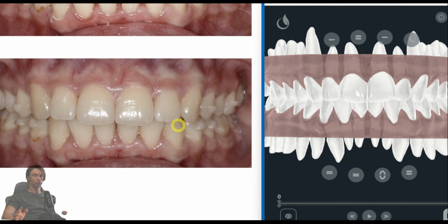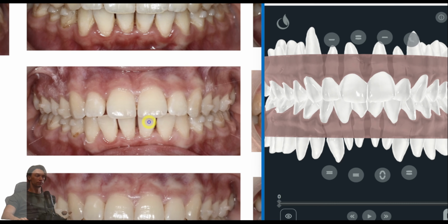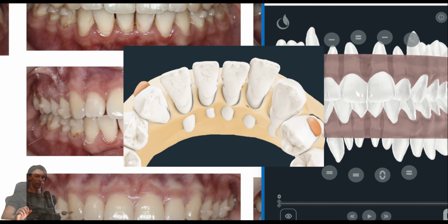So, what conclusions can we draw from this case? Do not be afraid of round tripping. I strongly recommend practicing it, but always pay attention to the bone. If the teeth move beyond the cortical plate, you must proceed with caution.